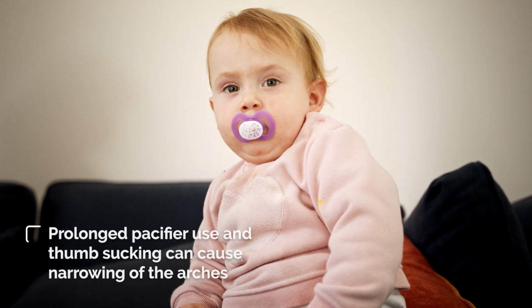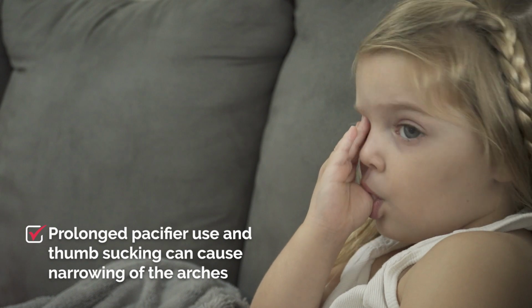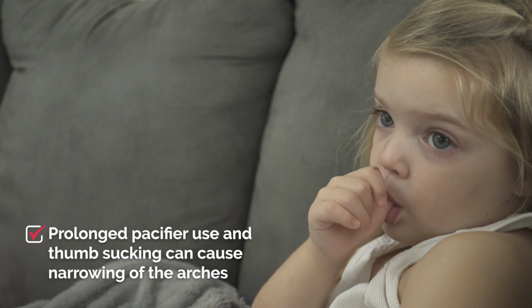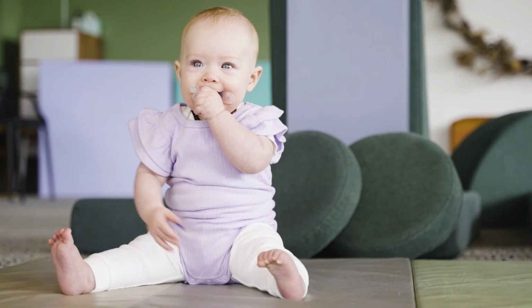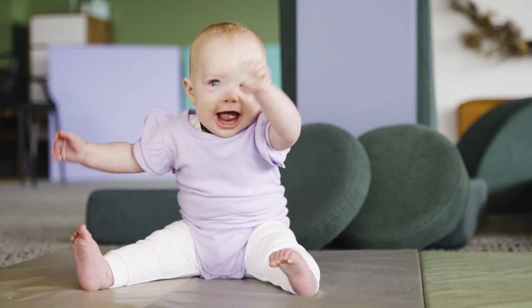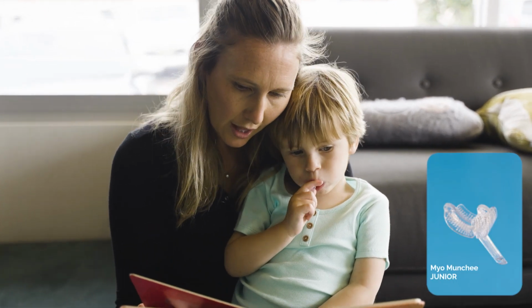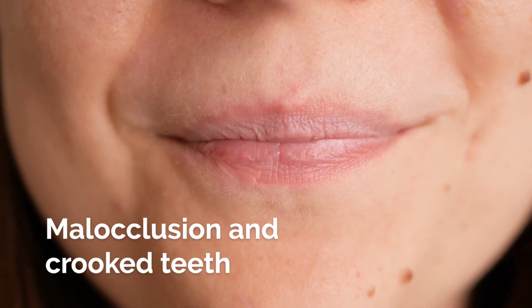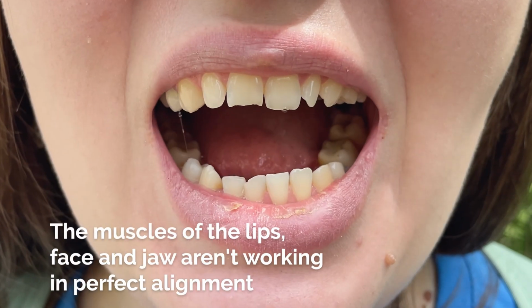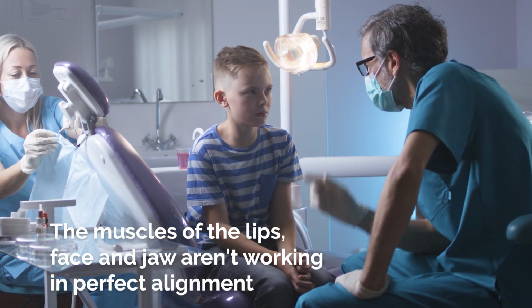If they have had prolonged pacifier use and thumb sucking, then this will often cause narrowing of the arches, and once again we have the jaws being smaller and maybe some low tone around the mouth as well. So these children may need to start with a smaller appliance and move up to a larger one once they can manage it. And the same with malocclusion and crooked teeth. If the balance of the teeth are crooked and the jaws are out of alignment, then the muscles of the lips, face and jaws are not working in the perfect balance we'd like to see.